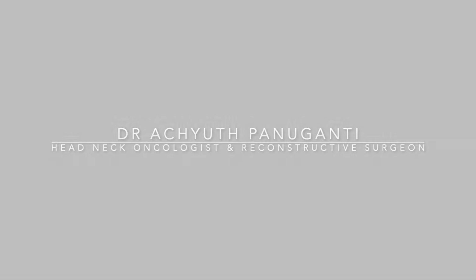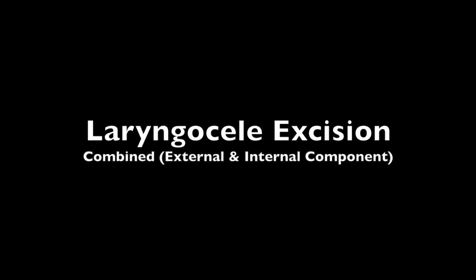Friends, welcome to the video presentation of Laryngocele Excision. This is a combined laryngocele where you can see the external and the internal component.